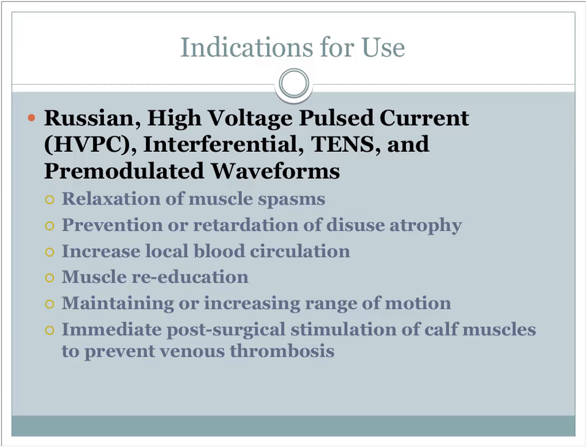It's a great intervention. Immediate post-surgical stimulation of calf muscles to prevent venous thrombosis. Basically what you're doing is you're just helping to stimulate that normal muscle pumping action. Put the stim on, make the muscles contract. You're actually squeezing the blood vessels, the venous system, so that it's going to return the blood out of the lower extremities, so that you'll have a lot less likely incidence of blood clot formation.